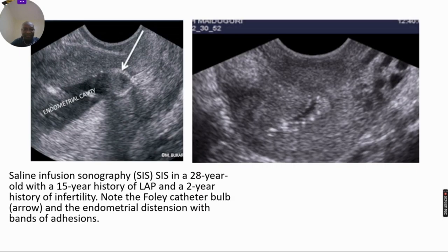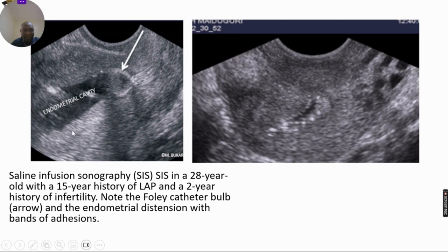Now let's look at adhesions. This was a 28-year-old with a 15-year history of low abdominal pain and a history of infertility. This is the catheter balloon and the endometrial cavity. Note the thickness and folds of the endometrium and look at bands of tissue crossing the endometrial cavity — these are bands of adhesions, intrauterine adhesions.